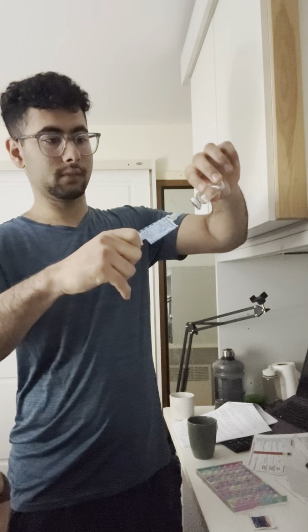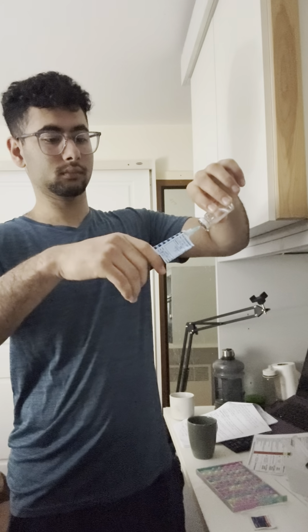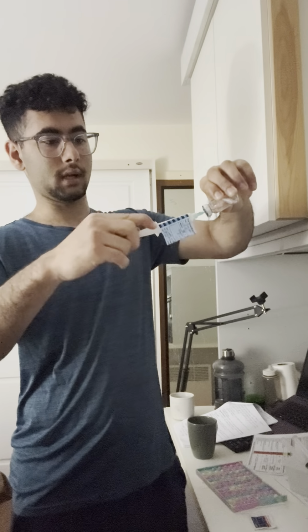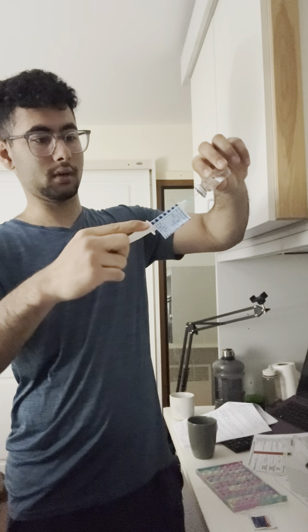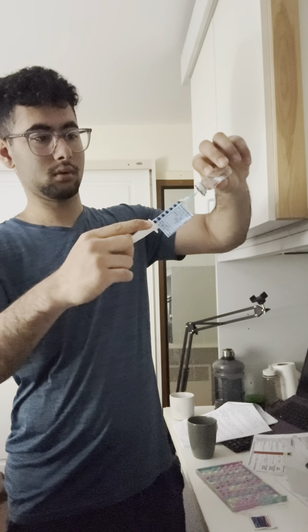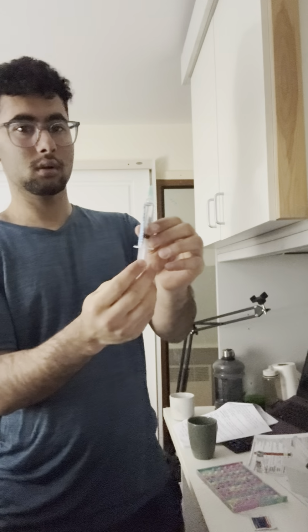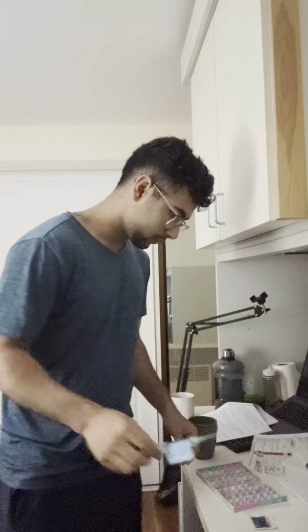Draw like this. It's kind of really hard because it's creating a vacuum there. Alright, cool. Now I've drawn 10 ml. Right? Now I'm going to take it back.